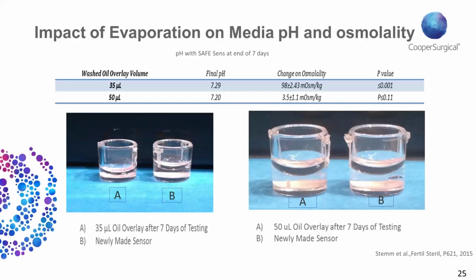Now, this is a very telling paper from 2015 that shows the effect of oil volume on the stability of the culture system.